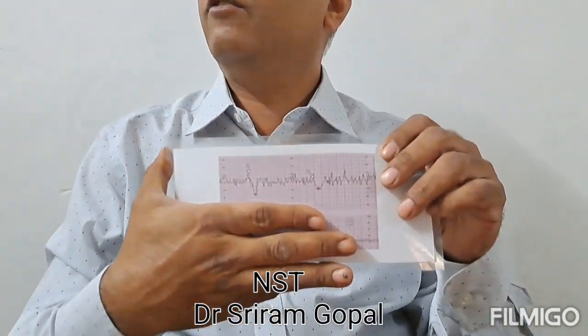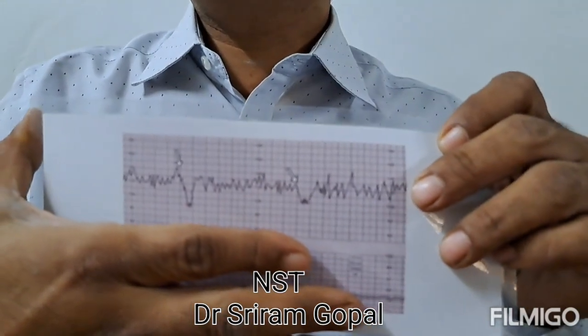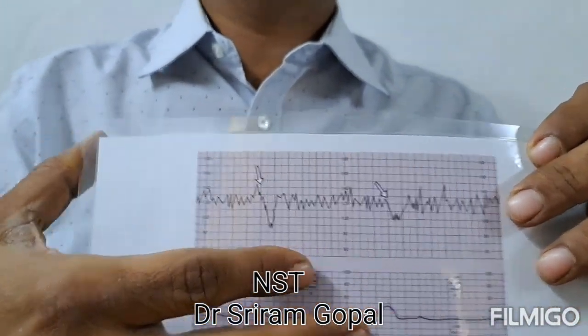But the baby is not completely formed. It's still in the process of getting formed. The autonomic nervous system is not completely formed. The cardiovascular system is not completely formed. So what happens to the heart rate is that it goes up and down. So if you take your tracing, it would be a nice flat line, okay, at 70, 80 or whatever. But when you take a baby's tracing, it will not be flat, it will be juggling. Like this part. Okay, you see up and down. Okay? So that juggling, even if the baby is not moving, it will be like this.